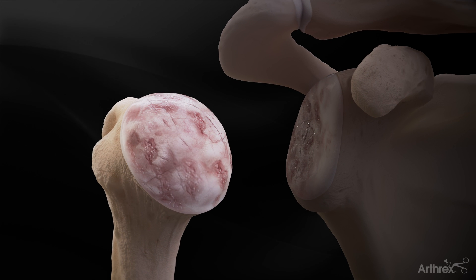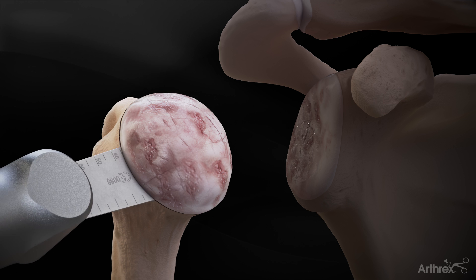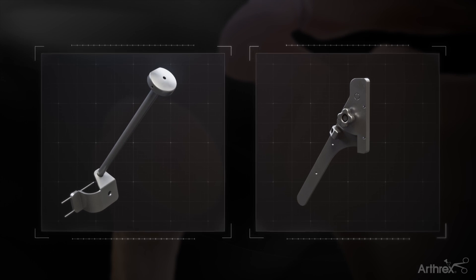Eclipse shoulder arthroplasty system. Resect the humeral head at the anatomic neck. This can be performed freehand or with provided instrumentation.